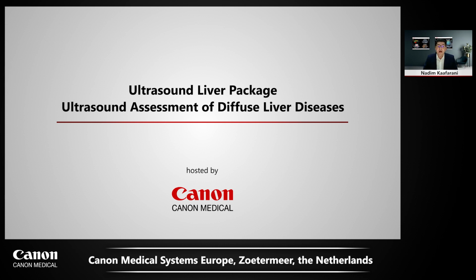This webinar will introduce some advanced ultrasound techniques used in the assessment of diffuse liver disease.